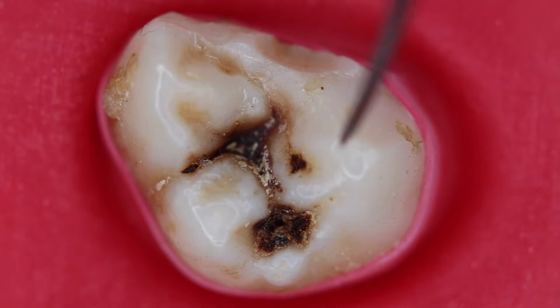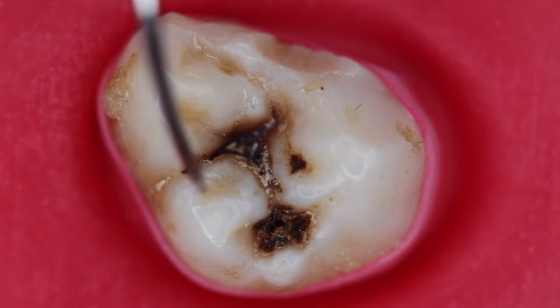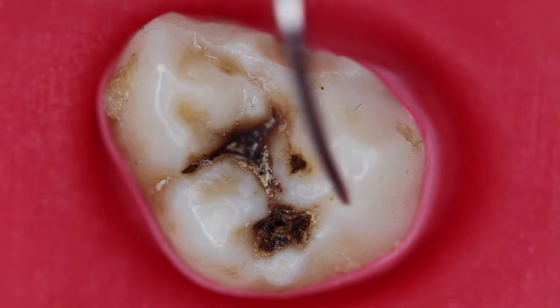This is a maxillary first molar, and in this molar there is caries, as you can see. We have planned to do the access cavity preparation for this molar. This is the mesial aspect, the mesiobuccal cusp, the distobuccal cusp, and the palatal cusp.